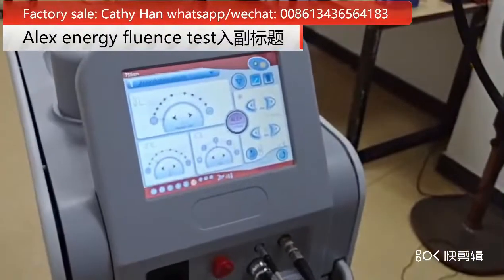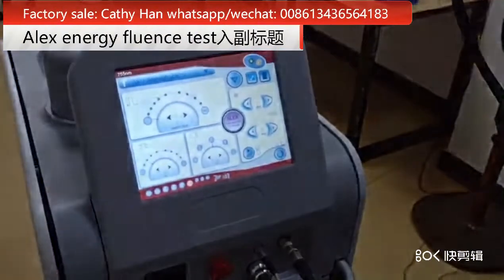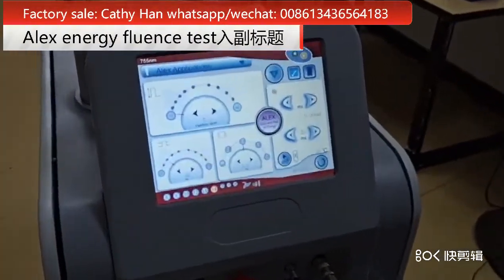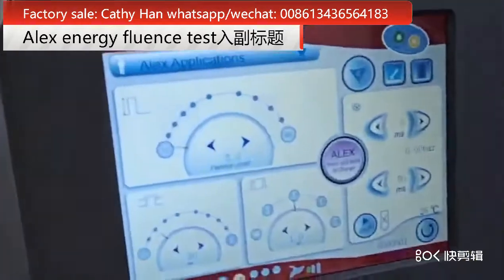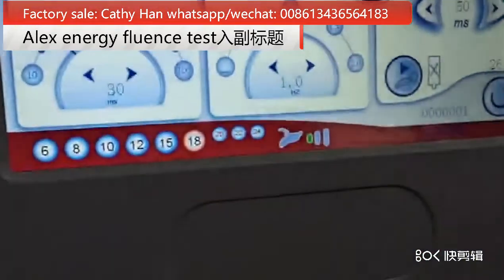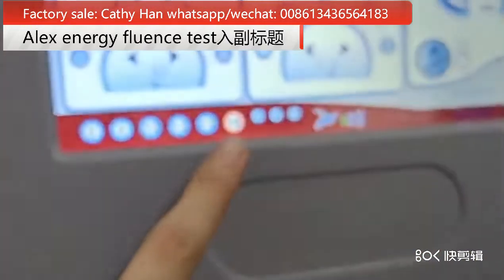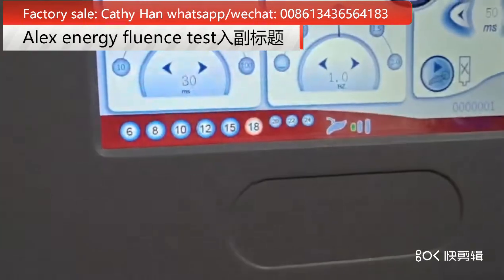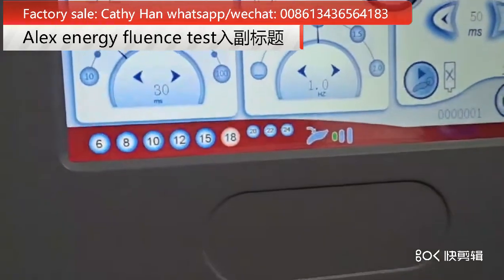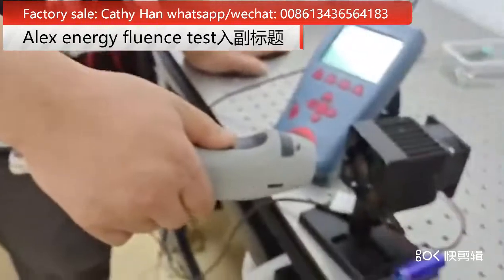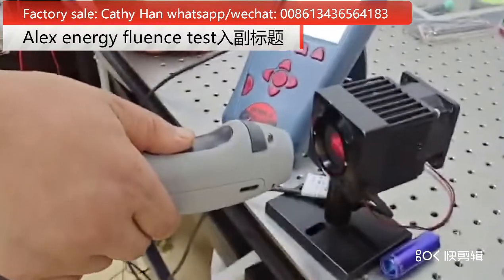Hello friends, now we will test the energy density for you. We can see the small size here is 18 millimeter and now we will test from here.